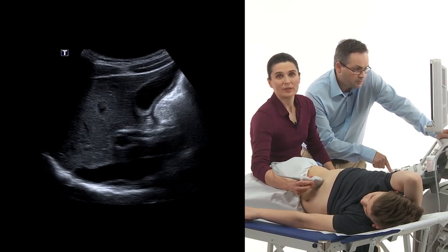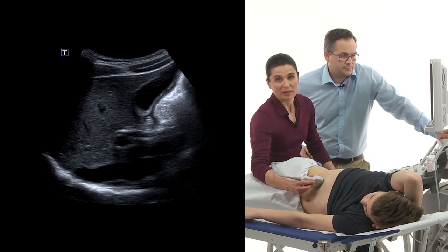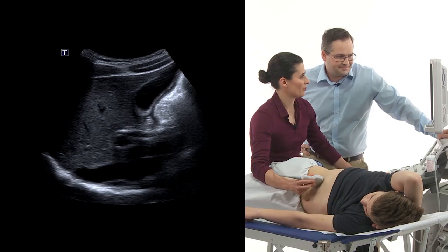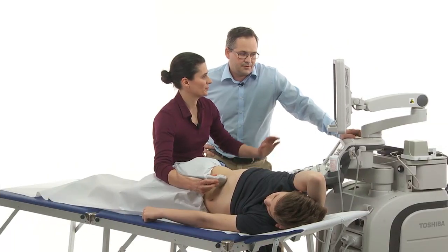When the gallbladder has been operated, the bile duct can be up to 10 millimeters, and this is still normal. But in this case, we can see the gallbladder over here, so there was no operation before. And this structure over here, just to tell, it's the IVC. This is another view we have to document in our report. So now we've got one last view for you.